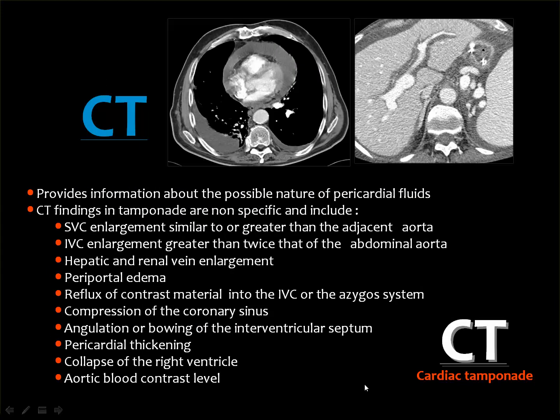These are easily appreciated findings on echocardiography. But the CT scan may also be of help, but remember that echocardiography is a simple procedure. The machine can go to the patient in the ICU, and you have the Doppler facility and the usual ultrasound imaging, which can also show pulmonary changes and pleural effusion. Then the CT may help in assessment of the pericardial collection, and also the associated pleural collection. The CT signs of cardiac tamponade are non-specific.